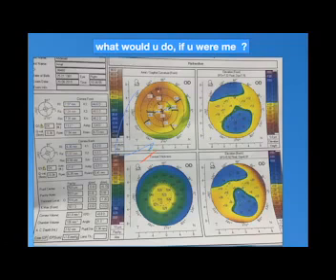Yes. So the abnormality in this topography is decentration, displacement of the thinnest location in the y axis. I have just a steep cornea. K max is 50 in the upper cornea.